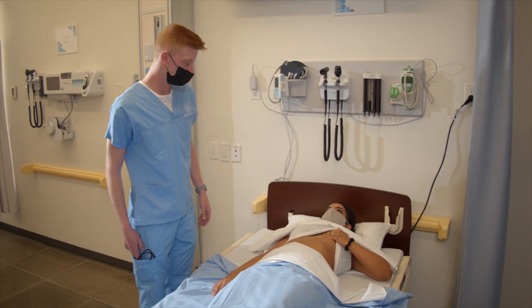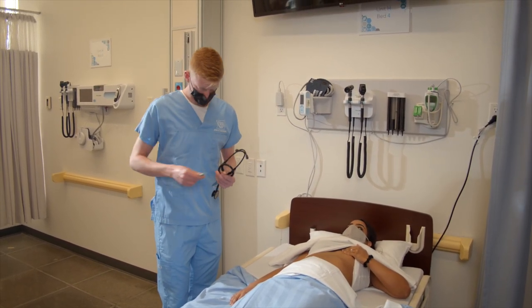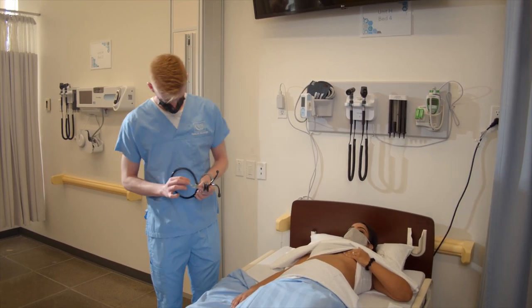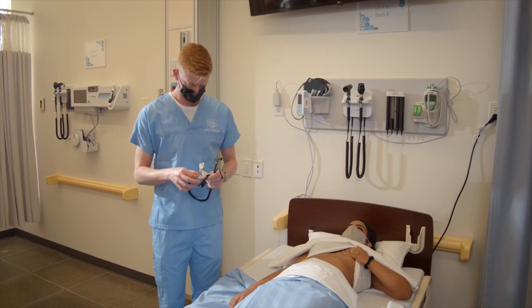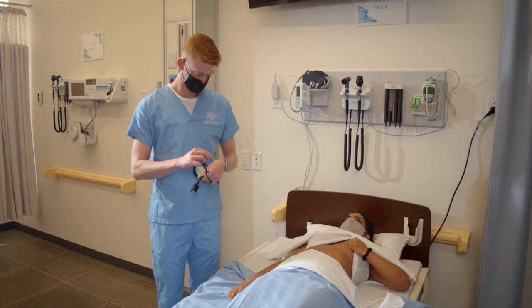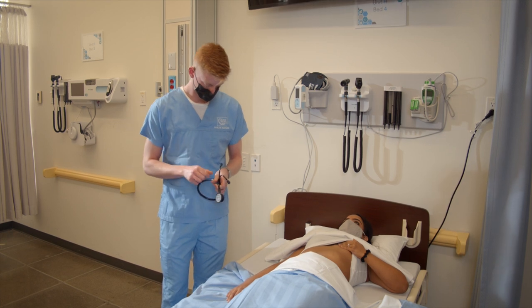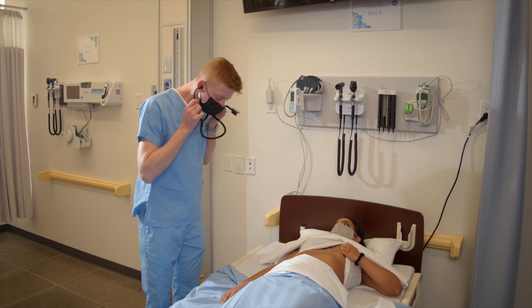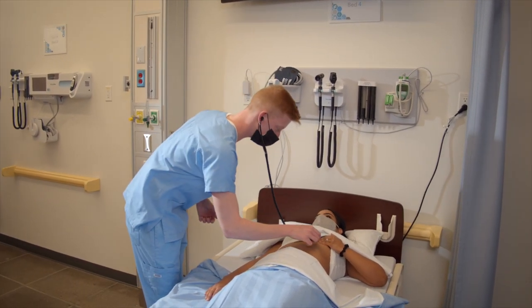I'm going to place my stethoscope on your chest now. Just give me one moment to cleanse it. I'm just going to put my stethoscope here.